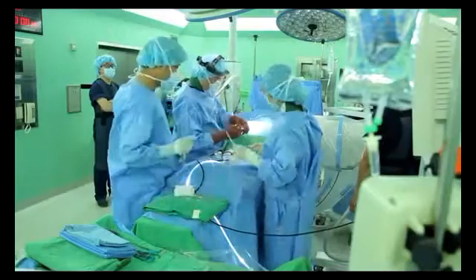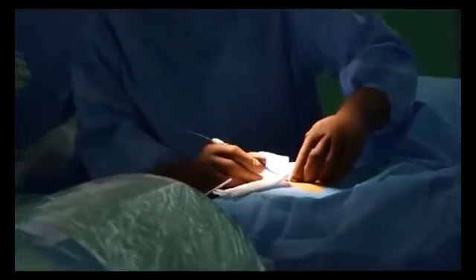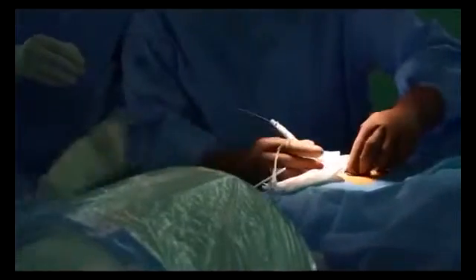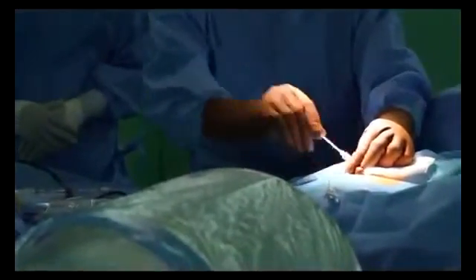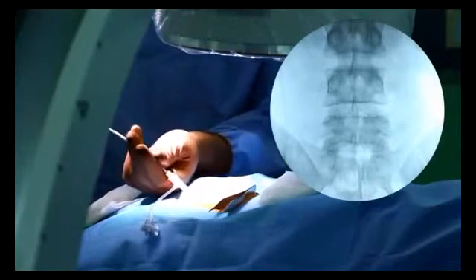Remove the needle, leaving the guide wire in the hiatus, and then a dilator is introduced over the guide wire. Remove the dilator and then put the stylet and sheath onto the guide wire. After the stylet and sheath are placed in the hiatus, take out the guide wire. Remove the stylet, leaving the sheath in the hiatus. Insert the catheter into the targeted treatment point over the sheath.